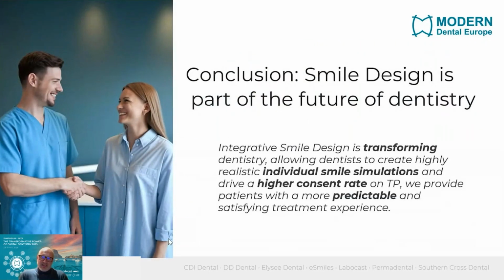So actually smile design, and for sure this integrative smile design, where you see 3D, 4D integration, this is already today a part of the future of dentistry. It's really transforming dentistry, and it allows dentists to really create precise, individual smile simulations, leading to a higher consent rate of treatment plans, and of course a satisfying end result, a satisfying overall treatment experience for our patients.